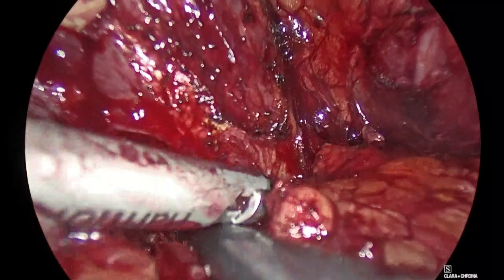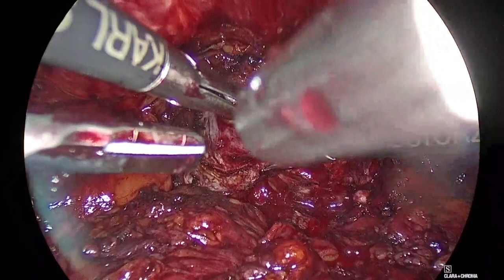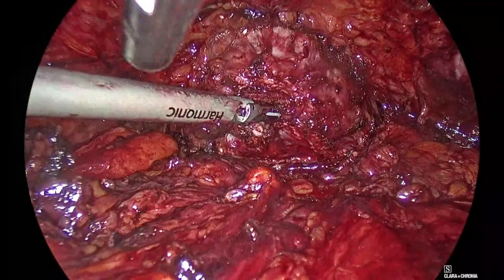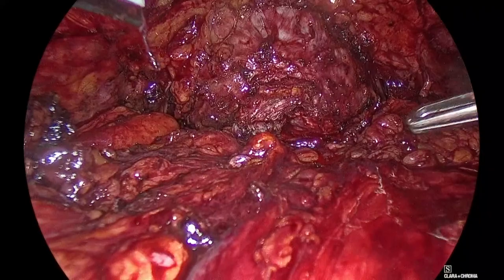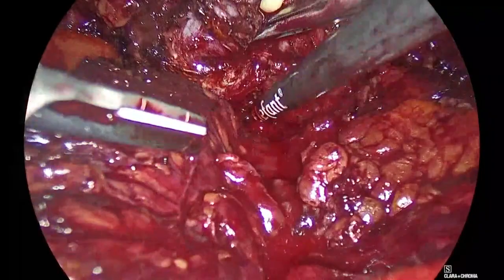Okay, central, Panagiotis, grasp, leave the catheter. Good, grasp, good, prostate, yes, and pull it out. You need another grasper, take my grasper. Come. Evangelos, did you do the same in case of big third lobe? Yes. With lateral, same approach? Same. Aspirate, Panagiotis. Aspirate.